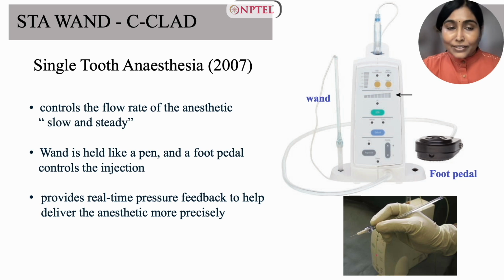The wand is the syringe, which is held like a pen, and you have a foot pedal which controls the rate of injection. The device also provides a real-time pressure feedback to help in delivering the anesthetic more precisely according to the tissues into which you insert the needle.